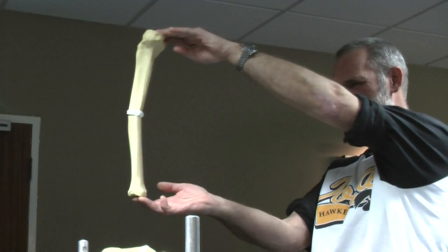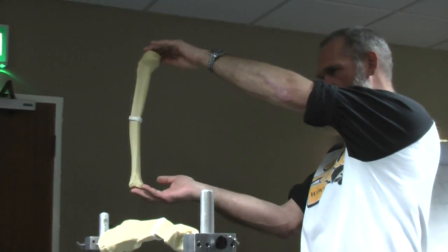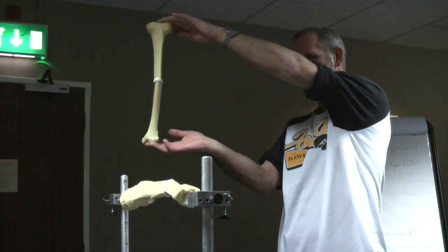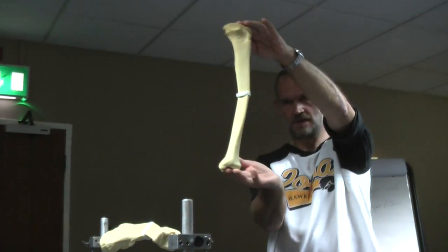We're going to talk about correction of an oblique plane angular deformity. Important things are, there is only a single deformity, it just happens not to be in a radiographer's plane. There is a point where that bone looks completely straight. And if I turn it through 90 degrees and do the same, there's a point at which it looks very bent. Yeah?